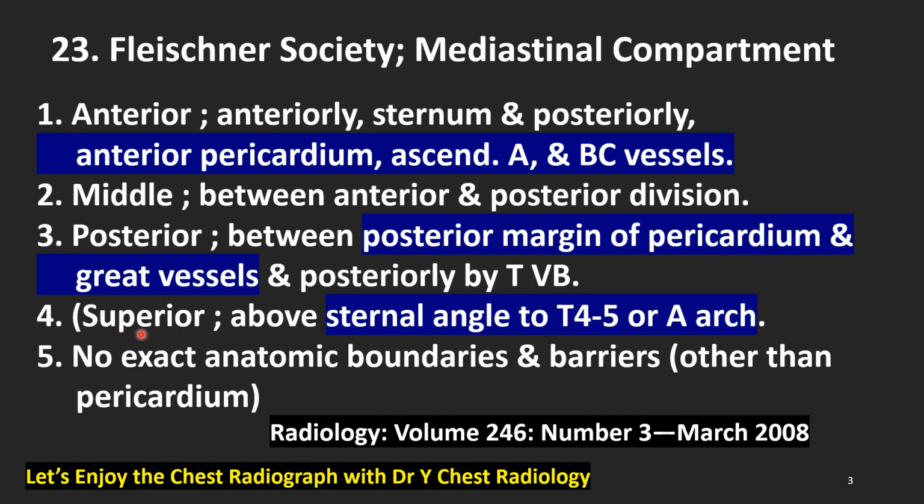Superior mediastinum is above the sternal angle, or T4 or 5 vertebral body, or just simply above the aortic arch. But there is a problem with this compartment concept because there are no exact anatomic boundaries and barriers in this lateral film-based concept of mediastinal compartment.